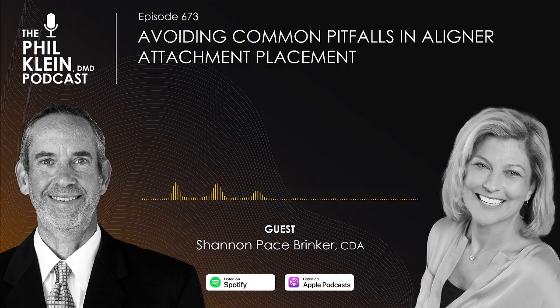So is the first thing you do place the OptraGate and then clean the enamel surface? Absolutely. First thing I do is put in the OptraGate to even try in my attachment template and try in my first aligner, because I want to see really clearly everything all the way around and make sure that I know exactly where these attachments are going to be placed.